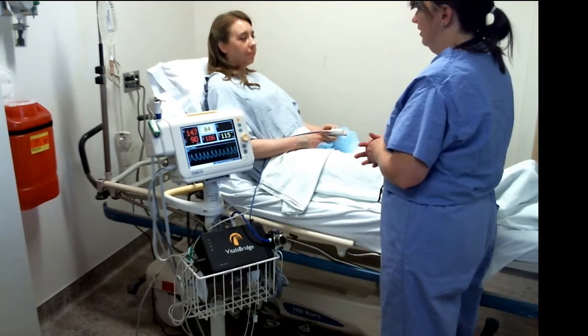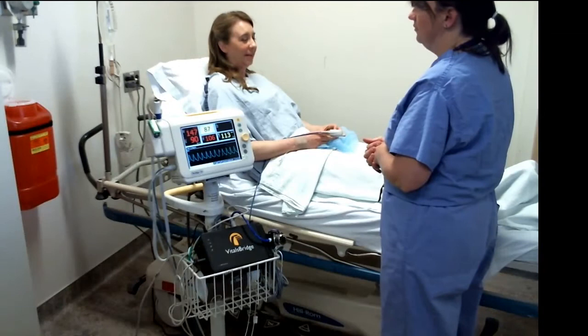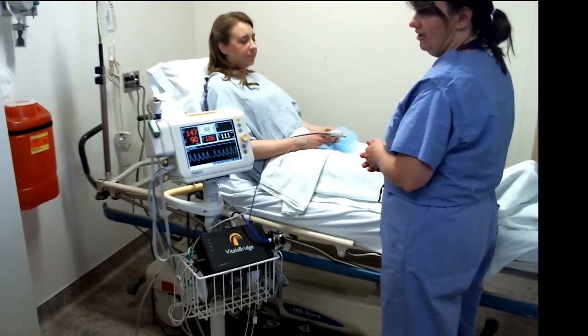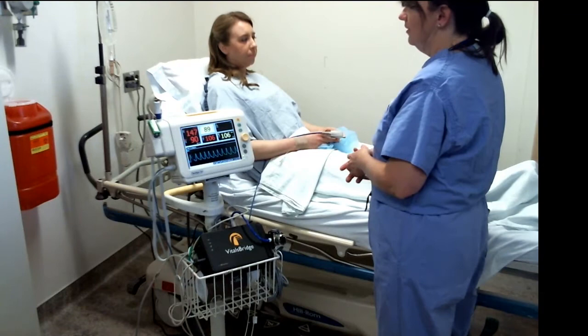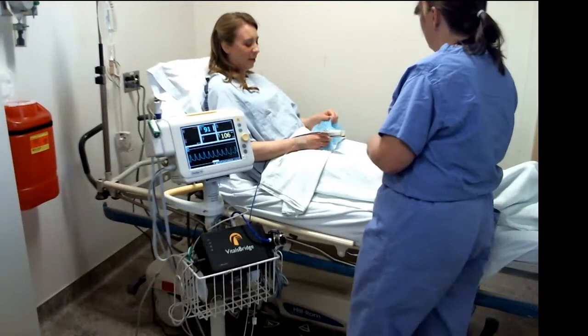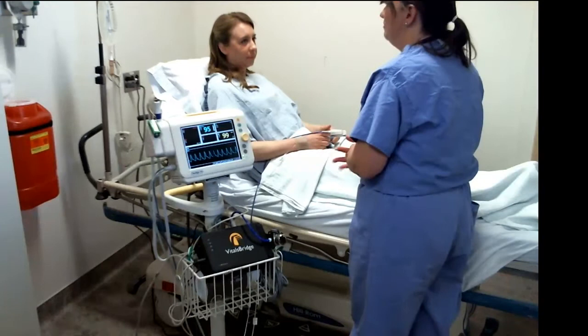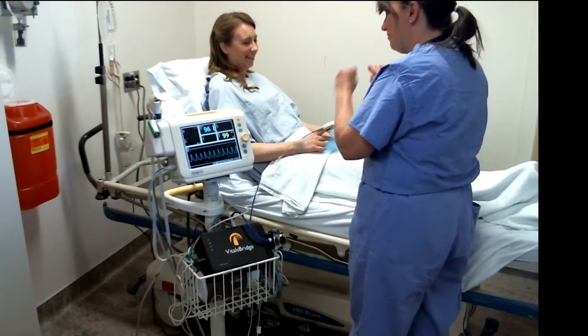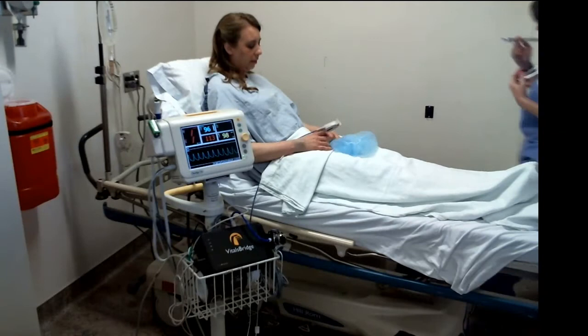Diane keeps the inhaler with the patient in case she needs more before reaching the operating room, reassuring her that they can handle it in the OR if it happens again. The nurse continues observing the monitor and notes the inhaler is starting to work — the patient's breathing is easing, as shown by improving numbers on the vitals monitor. The patient confirms she feels better.